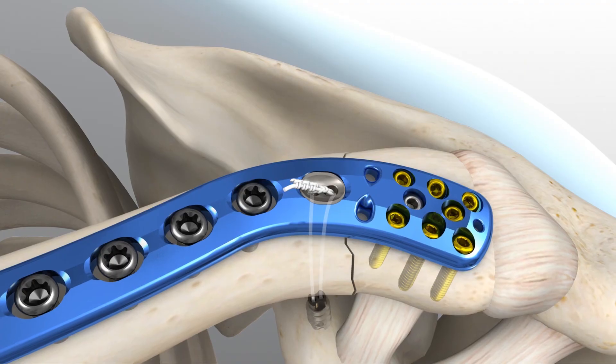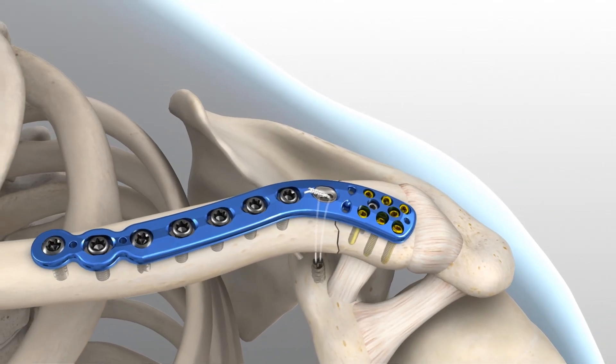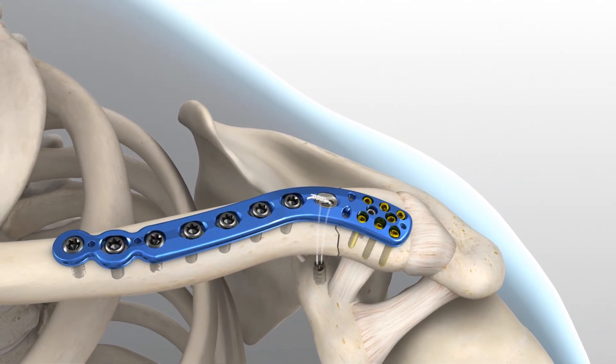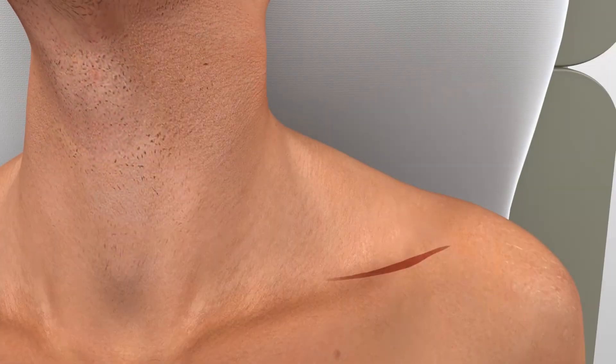This step completes the reduction and stabilization of the clavicle. Precautions should be taken when positioning the suture knot to avoid soft tissue irritation when closing the incision. Meticulous deltotrapezial fascia closure over the knot may help minimize skin irritation. An intraoperative radiograph is recommended to check the position of the screws and the final reduction of the fracture. After radiographic evaluation and routine irrigation, the trapezial deltoid fascia is closed over the clavicle and AC joint, followed by closure of the subcutaneous tissue and skin.